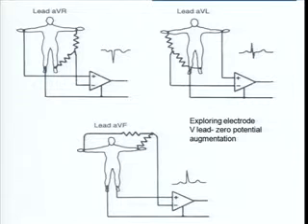Initially, when the leads were proposed, the graph they used to get was very small. They could not appreciate the various waveforms. So they augmented these leads so that a better picture could be obtained. So they are called augmented VR, VL or VF leads.